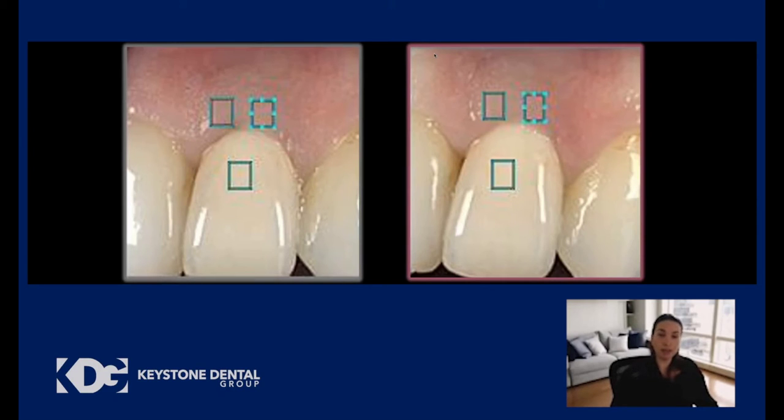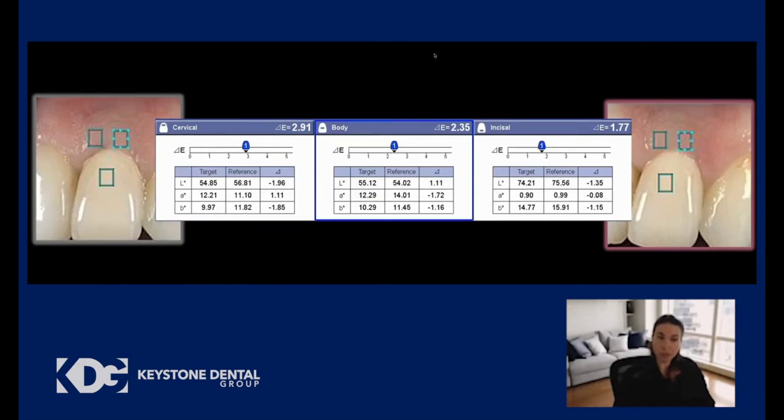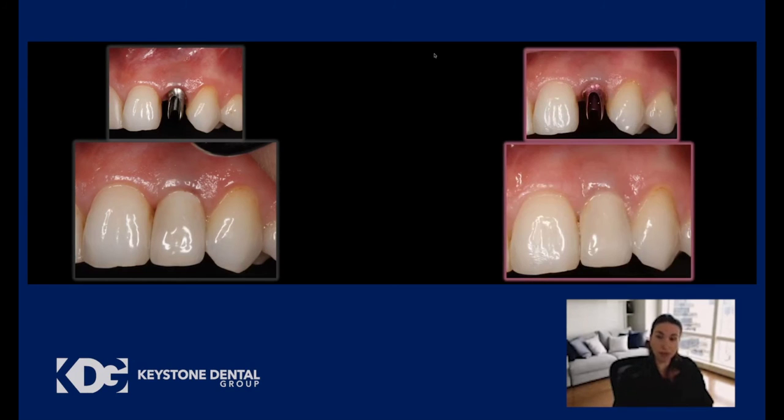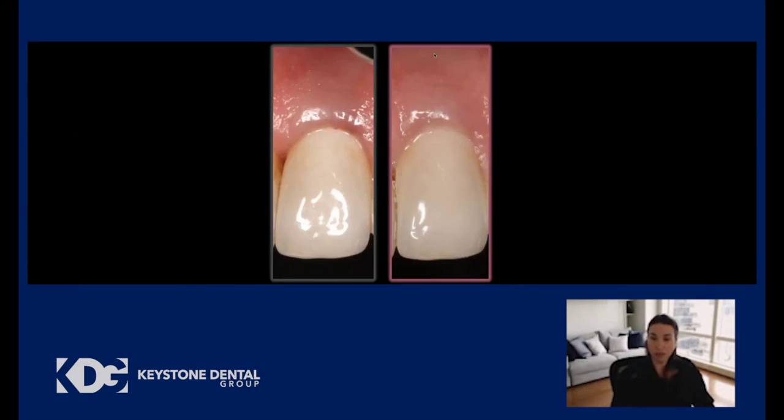So in this case, when we determine the difference between the gray abutment and the pink abutment that you see on the screen, we're going to see a delta E that is higher than what we saw with the thick tissue biotype, that was at the 1 level. So here is with the gray abutment, here is with the pink abutment, and here is the case where you see really a difference between the two abutments. If you do a close-up, you can really see that with the pink abutment, you are seeing the tissue with a much lighter color. It's a much better blend with the soft tissues.